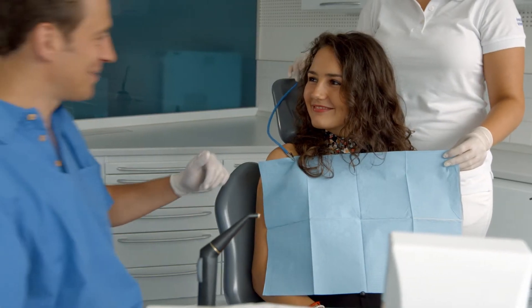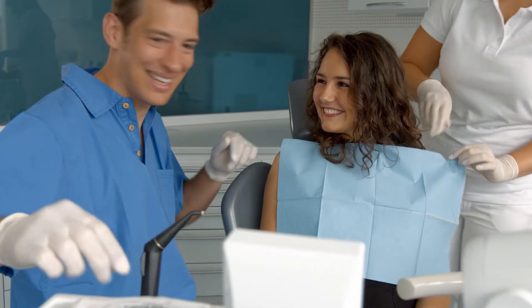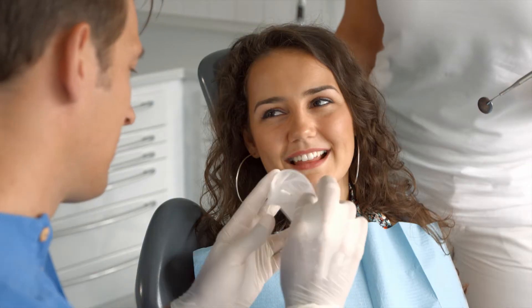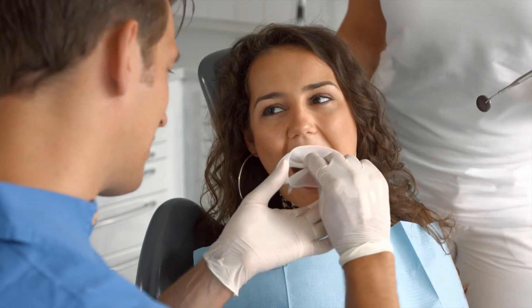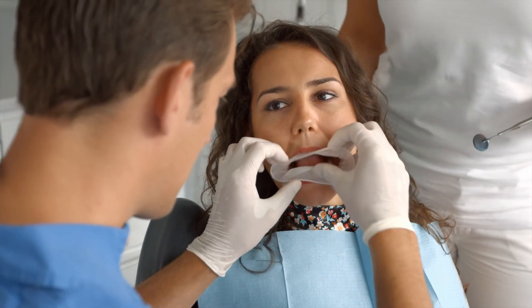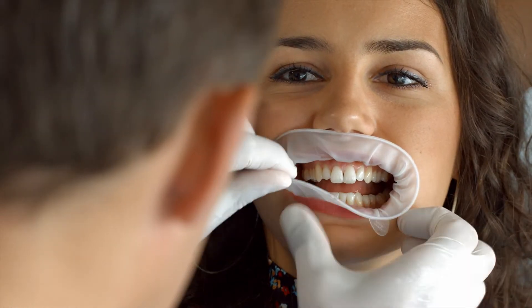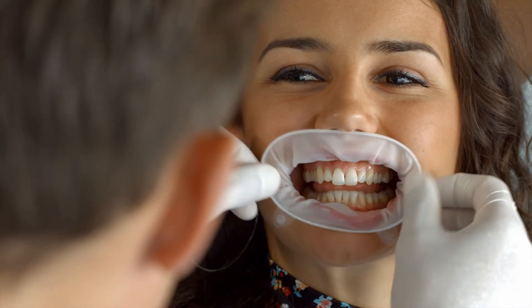Begin by selecting the reference teeth and taking a photograph of the patient's teeth. First, insert an Opturgate lip and cheek retractor into the patient's mouth. This allows you to obtain a clear view of the patient's tooth necks and eliminates any shadow in the incisors. Opturgate also facilitates the shade selection process. Make sure that the teeth are well moisturized and do not look dry.